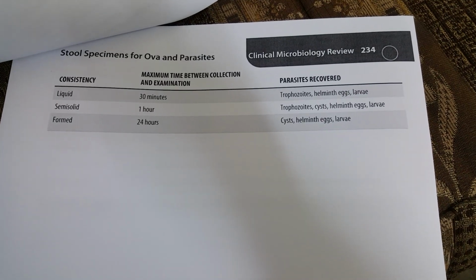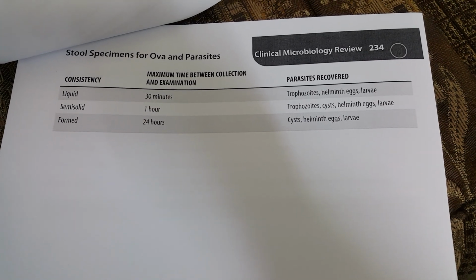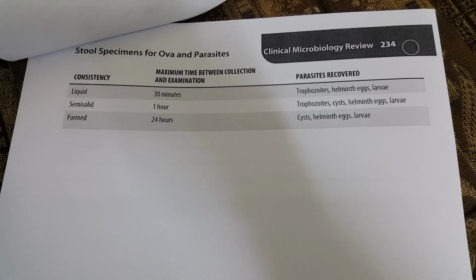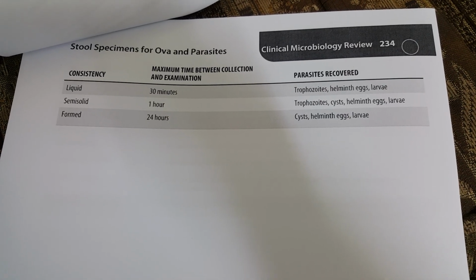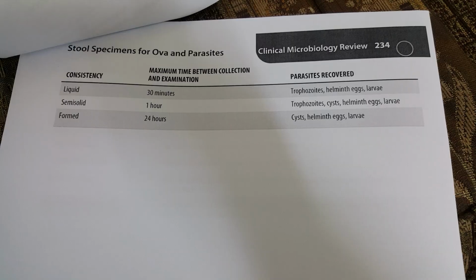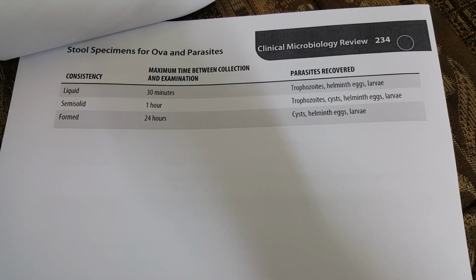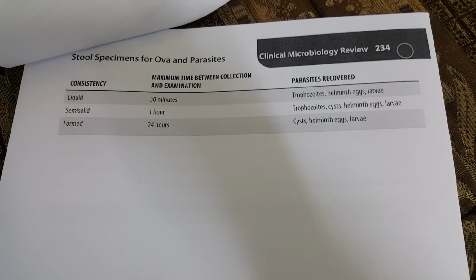In the stool routine examination, if the stool is liquid, it is recommended that you process it within 30 minutes for trophozoites, helminth eggs and larvae. If the stool is semi-solid, you have 1 hour to examine the trophozoites, cysts and helminth eggs under the light microscope. If it is formed stool, there will be no trophozoite form, so you can take 24 hours to check for cysts and helminth eggs or larvae.